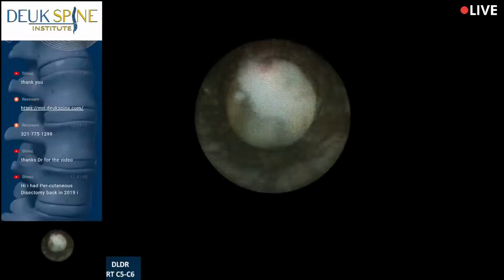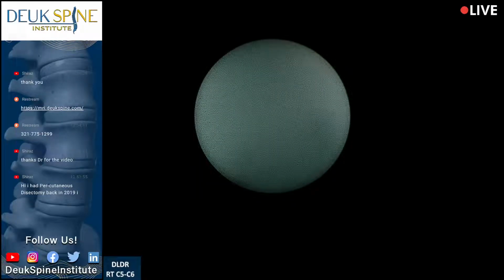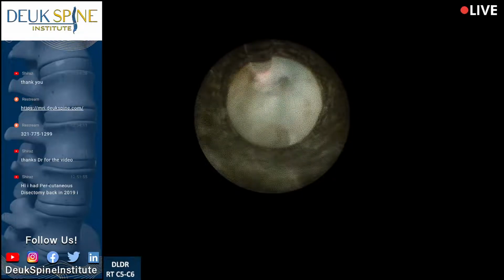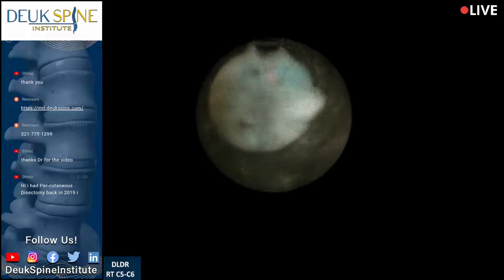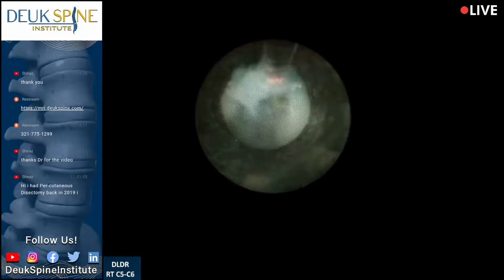Okay, we're still at it. There's another piece of herniation. Lots and lots of pieces of herniation. And again, we talk about this quite a bit. We talk about how a herniated disc is just not one herniation. It's actually a collection of many in most patients. And just how many? Well, that's really up to the individual patient. But I'd say we typically see between 20 to 30, literally 20 to 30 pieces of herniation per patient, per disc. There's another piece right there.